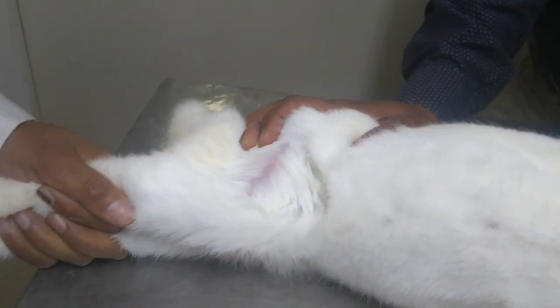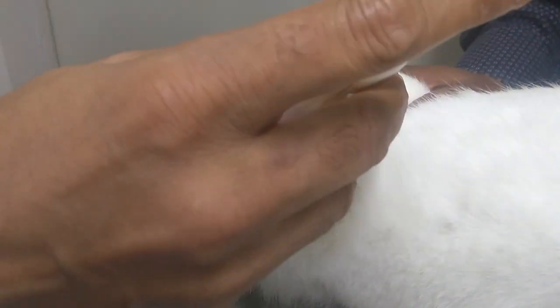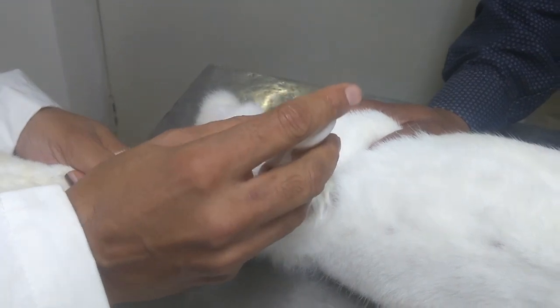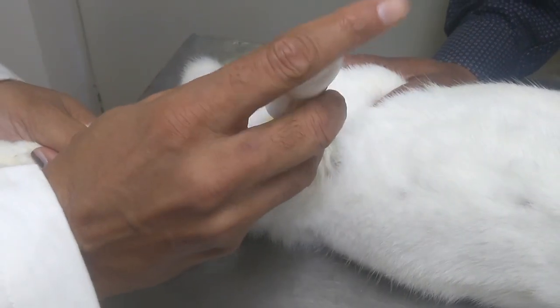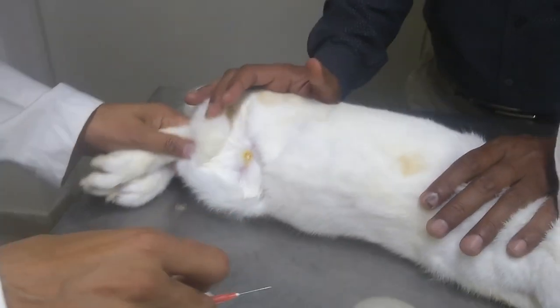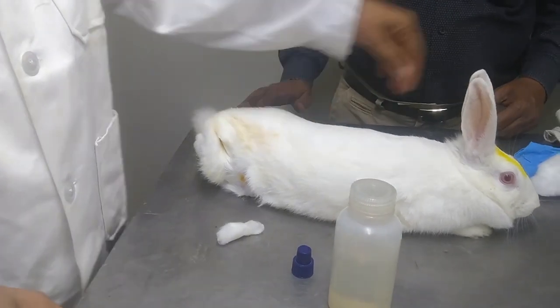Then we apply some antiseptic powder. Here it is betadine powder, so that infection cannot develop later on. We sprinkle some of it at the area of injection. And then slowly release, leave the animal relaxed, and it is immunized.